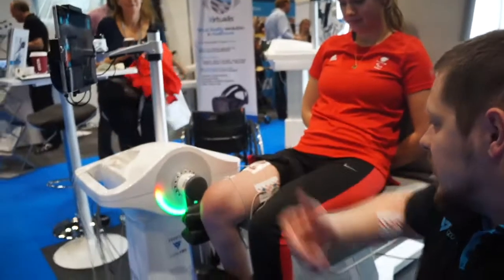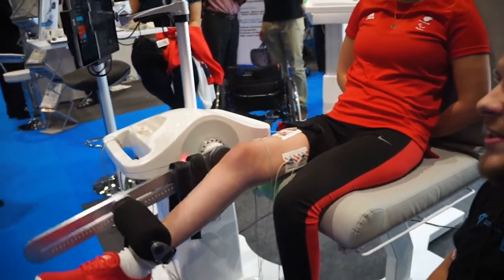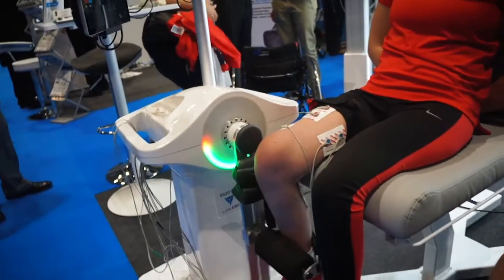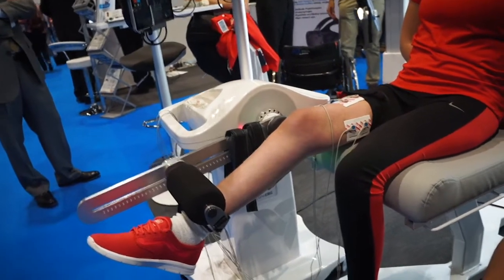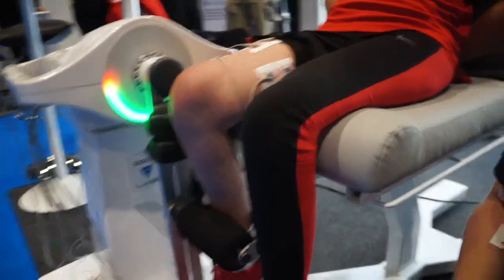Try to lift your leg up now. Luna is assisting with that, but only if Izzy is holding the contraction. While relaxed, Luna will go down, and while Izzy is contracting the right muscle, Luna will actually go up — and only while the contraction holds will it move.